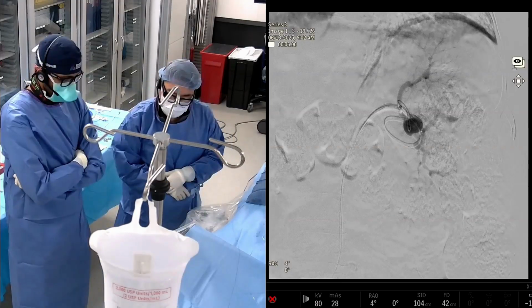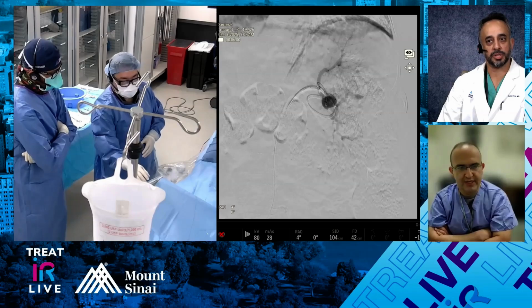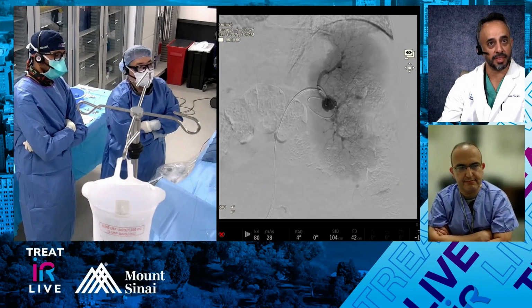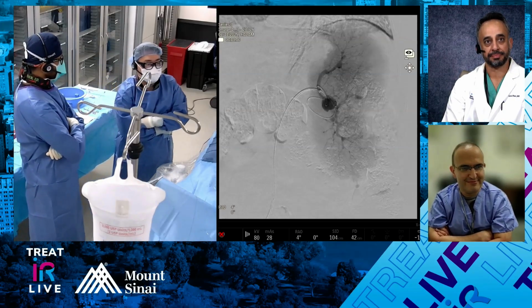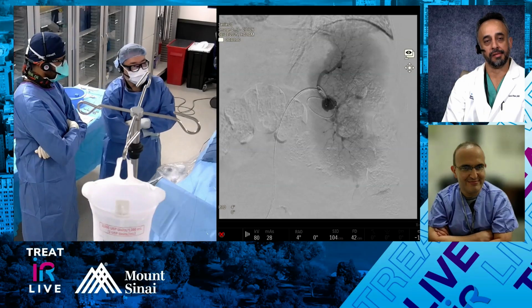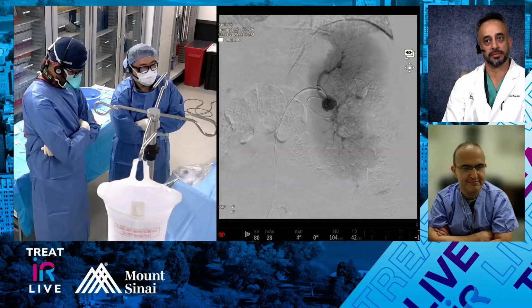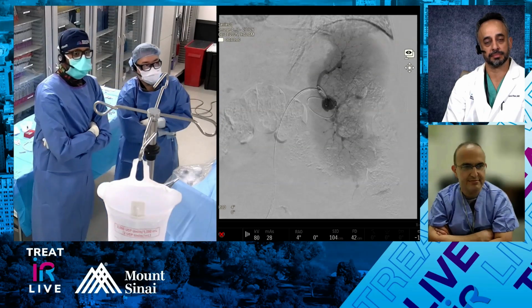Yeah, so given how distal it is, we've all had this thought: should we try to do a stent-assisted coil or put in a covered stent to preserve the distal flow? What are your thoughts on that? And correct me if I'm wrong, Rahul, you might be first author. I don't remember, but our group published our experience on splenic artery aneurysm embolizations, and we might have one of the largest series that's been published. I don't think any of them were stent-assisted coiling.